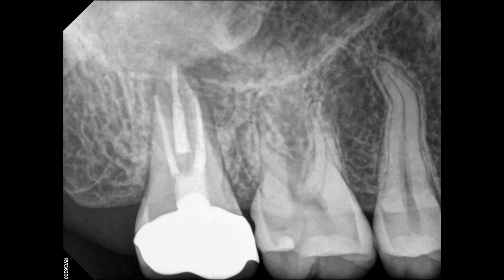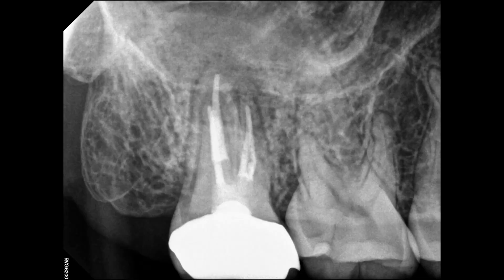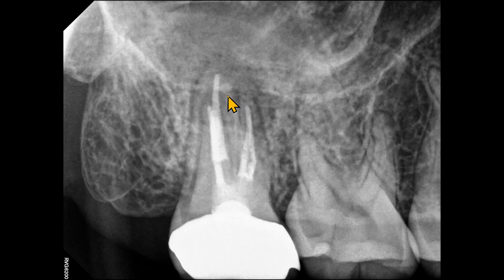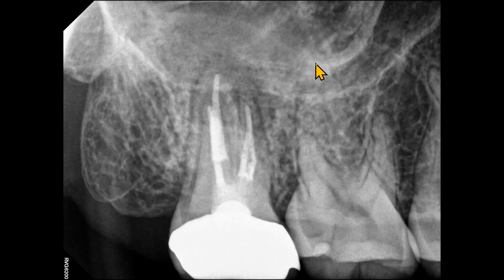We have one more periapical radiograph of the same patient, taken on the same day. We can see the radiolucency here, and we can also see the loss of sinus floor cortication. The additional information we see is a smooth radiopacity on the floor of the sinus, which may indicate a retention pseudocyst. We can also see that there are probably two canals on the mesiobuccal root.